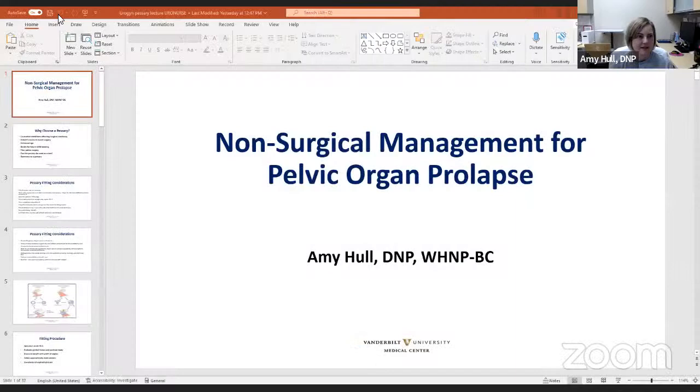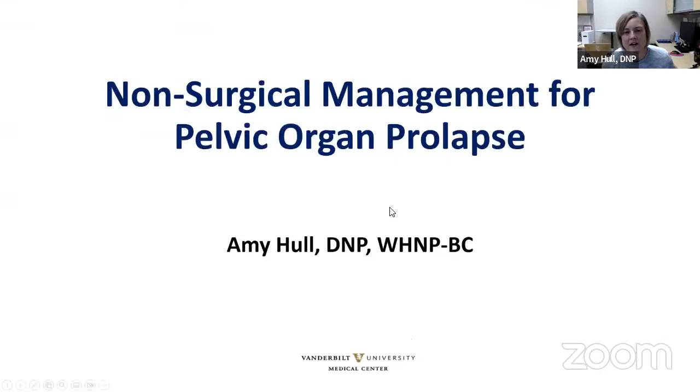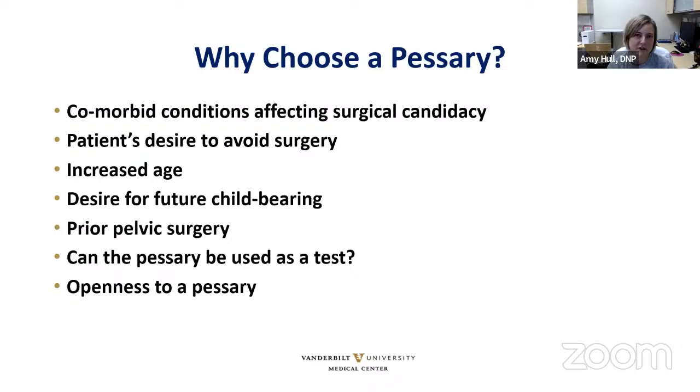So obviously, yes, we are talking non-surgical management for prolapse, aka pessary management. So I'm going to dive right in and we'll get going with it. So the first questions that we have to figure out when we're trying to figure out if we even want to use a pessary or if a patient wants a pessary, we have to figure out who are the best candidates. And typically those best candidates are the ones that either don't want surgery, can't have surgery, or just want to delay surgery until it's a little bit more opportune for them.